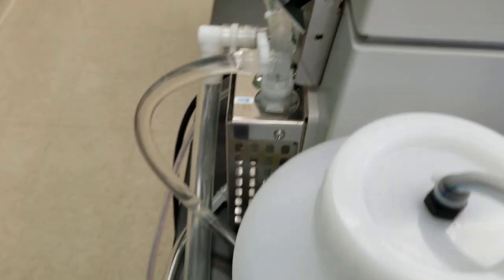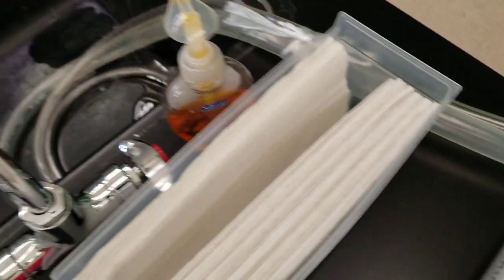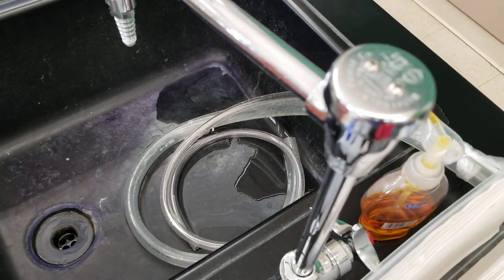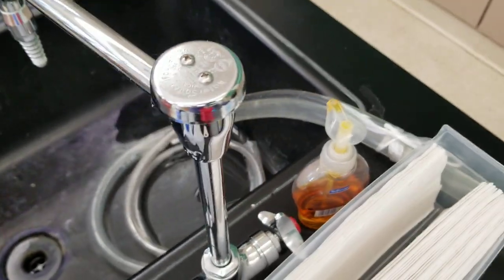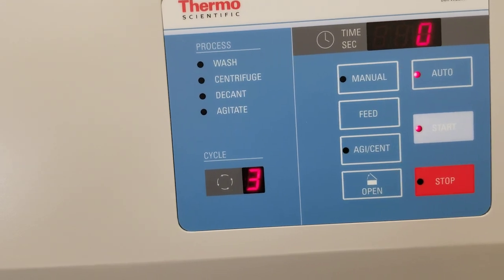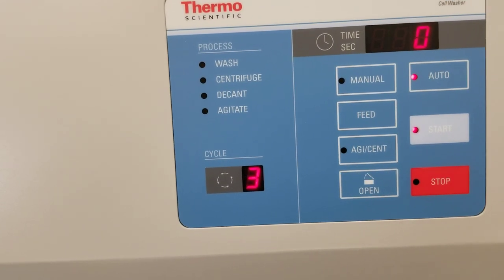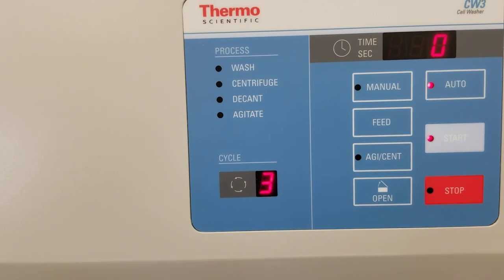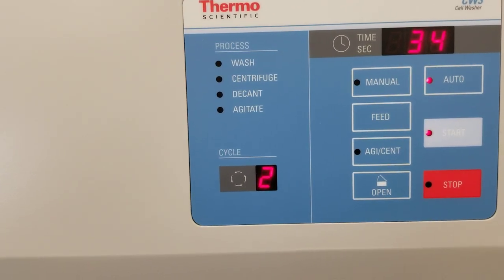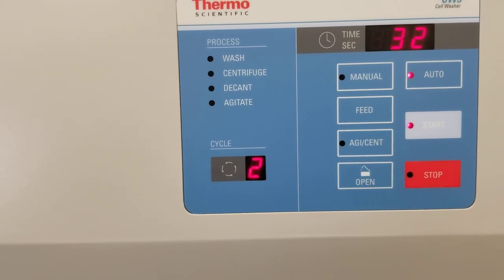You'll notice though, that the tubing also then goes out and to the sink. And depending on where you are in your cycles, that fluid will come out. So we just did one cycle of wash, then centrifuge and decant. That was the fluid going out. Then we agitated and now we're back to wash again. So that was the first cycle. So now we have two left.